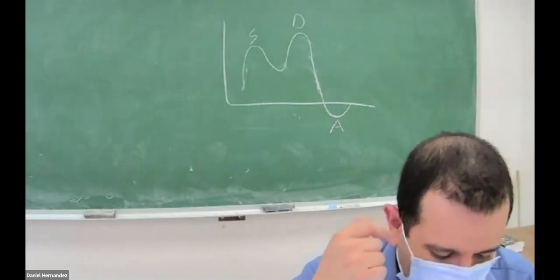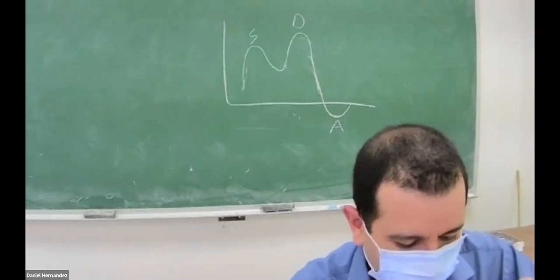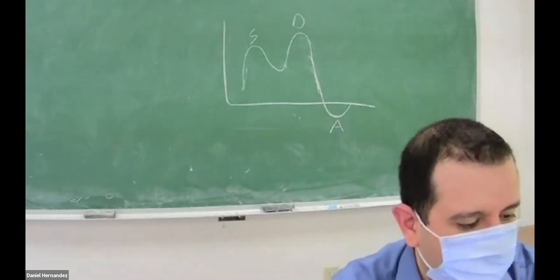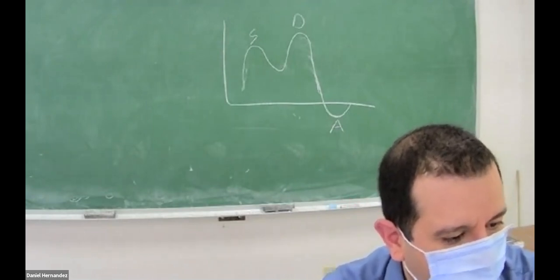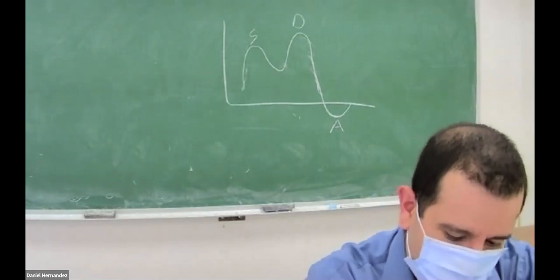So we said that aortic stenosis, sclerosis, yeah, it's going to be degenerative, so aortic sclerosis. Yep, aortic sclerosis.